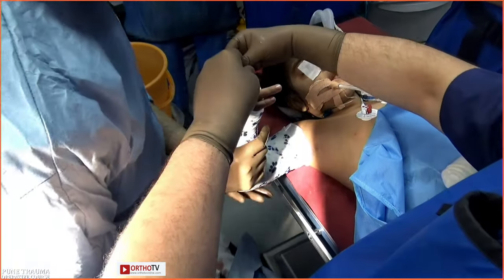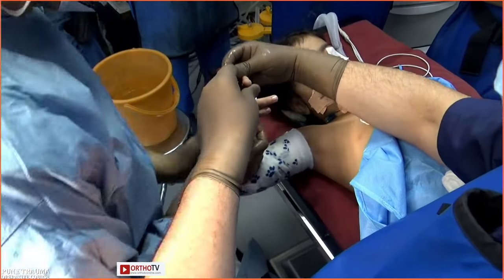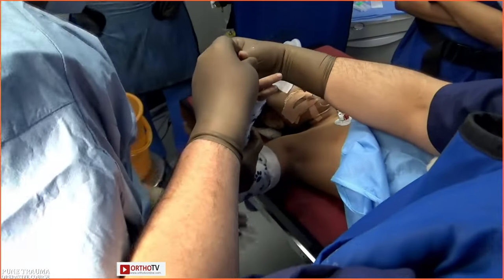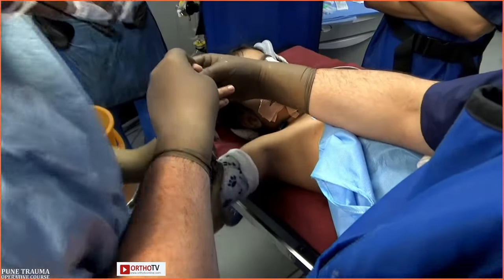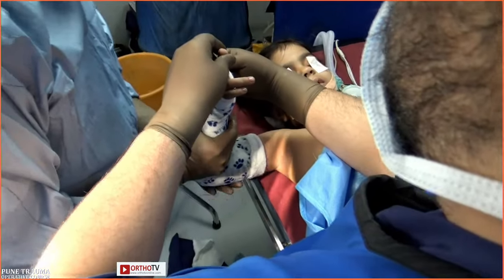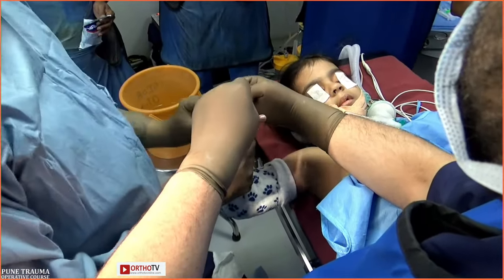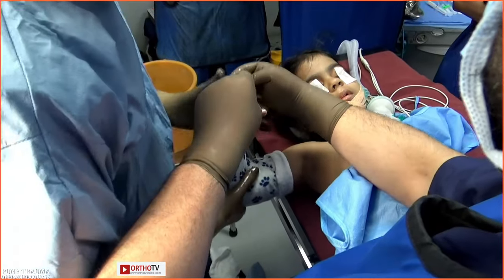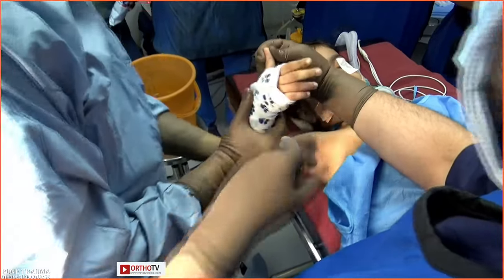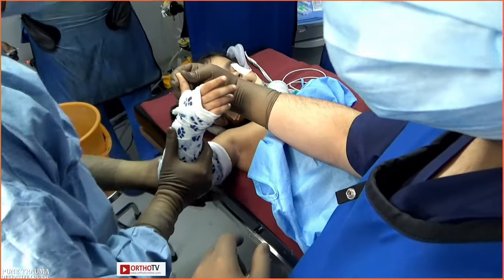And this is an excellent soft cast which can be unwrapped in the OPD. You don't need a cutter for this. Most of the kids are pretty happy with this kind of plaster, which gives them comfort. There are some waterproof liners also available, but I am not very comfortable allowing them bathing facility. Secondly, waterproof liners in our country don't work. A lot of children get allergy, sweat, and the water remains inside and they get skin rashes. By nature we Indians sweat, so I don't think waterproof liners work. Now you can see the cast does not need to be in acute flexion, and that makes it very comfortable.